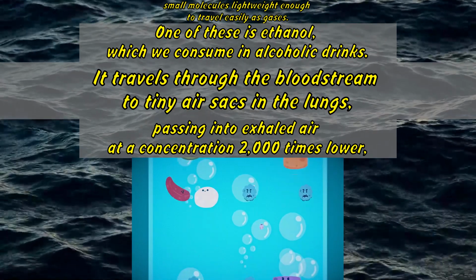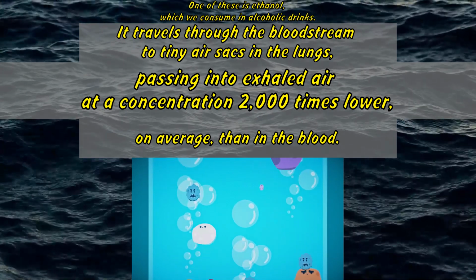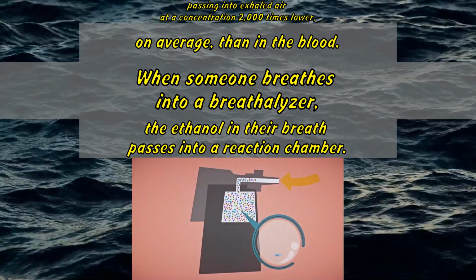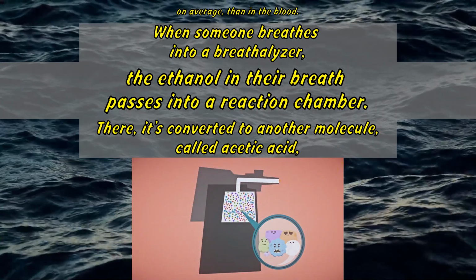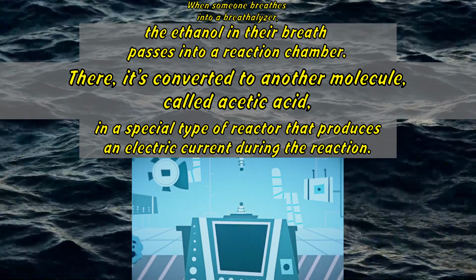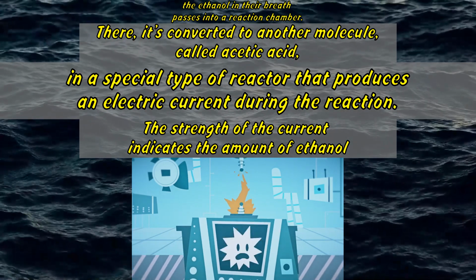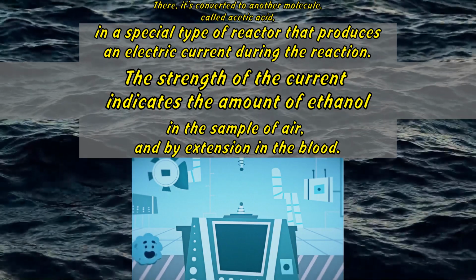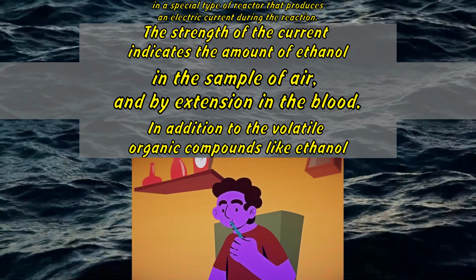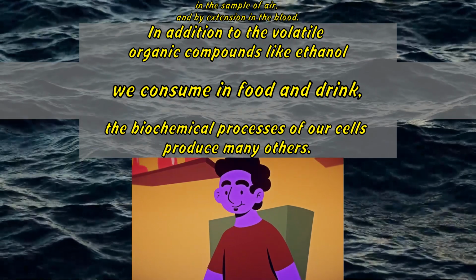It travels through the bloodstream to tiny air sacs in the lungs, passing into exhaled air at a concentration 2,000 times lower, on average, than in the blood. When someone breathes into a breathalyzer, the ethanol in their breath passes into a reaction chamber. There, it's converted to another molecule, called acetic acid, in a special type of reactor that produces an electric current during the reaction. The strength of the current indicates the amount of ethanol in the sample of air, and by extension, in the blood.